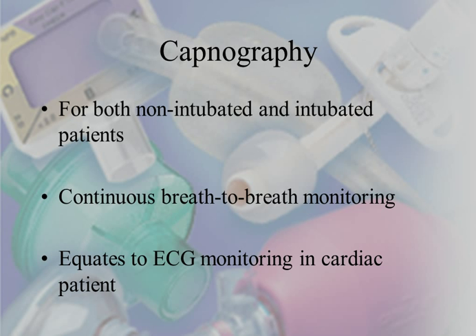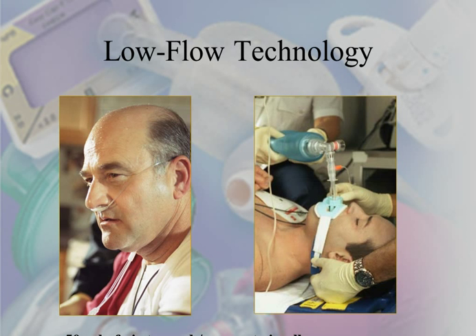Remember, we use capnography for both the non-intubated and the intubated patient. It gives us continuous breath-to-breath monitoring. It equates to basically ECG monitoring in a cardiac patient. Remember that we can use low flow technology, and it's accurate in all age groups, regardless of the age.